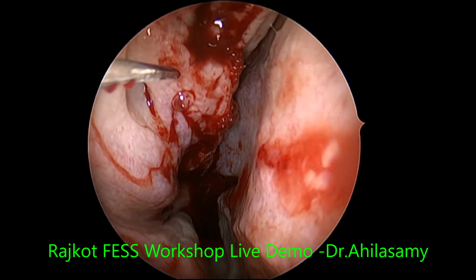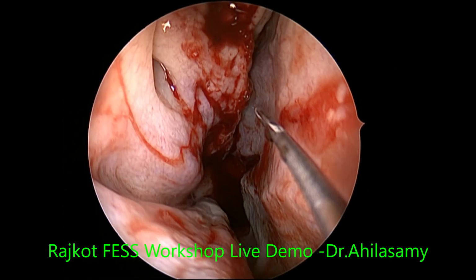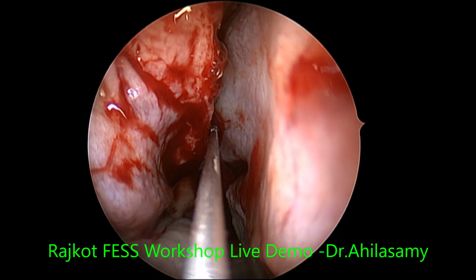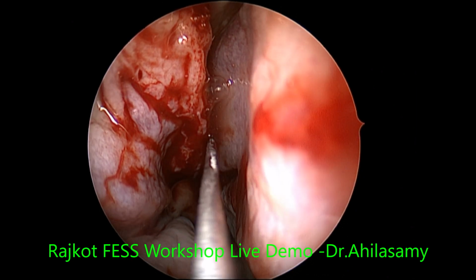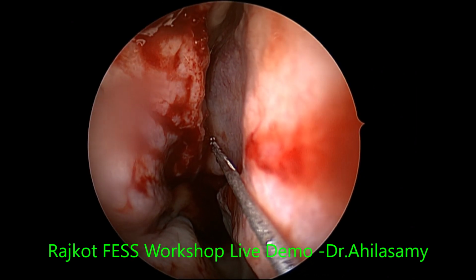I give an added infiltration at the root of the middle turbinate. Actually, I have to give it on the anterior face of the sphenoid sinus, that area exactly. Yes, that gives an added cushion and has a little decongestion effect also, so it hardly bleeds during the surgery.